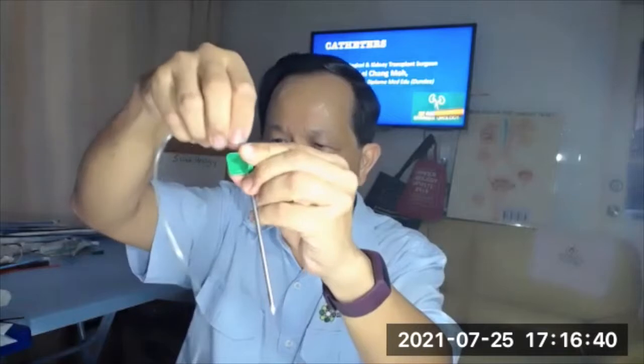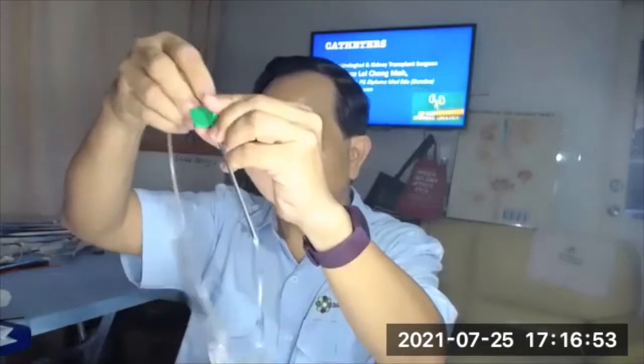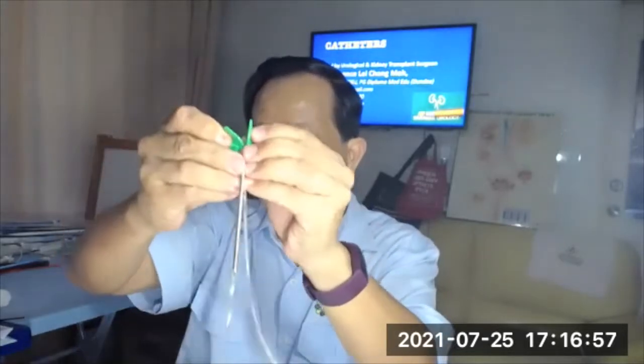The Cystofix is basically a catheter inserted over a metallic trocar. The metallic trocar is very sharp. You put it into the bladder and once it's inside, urine comes out and you insert the catheter into the bladder. Once it's in the bladder, you cannot manipulate it anymore because the sharp tip will cut the catheter. When removing it, make sure the entire trocar is withdrawn from the skin, otherwise breaking it to remove the stylet can cut through the catheter. The Cystofix is a very sharp catheter, cannot be reused, and there's no balloon so it can fall out easily. This is the one generally used in Malaysia.